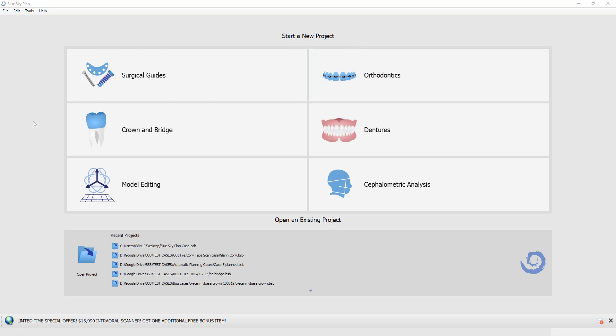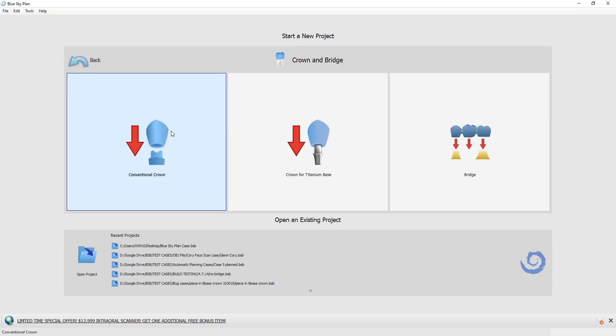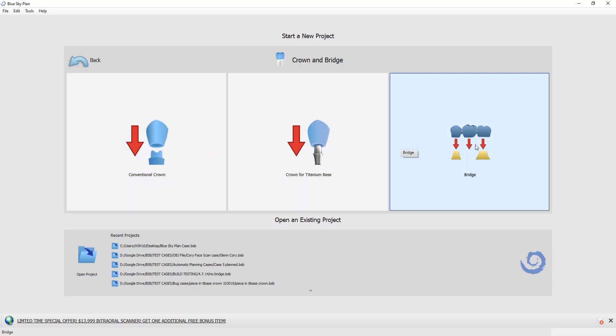We've launched the software and now we are going to click Crown and Bridge and then select the option for Bridge.